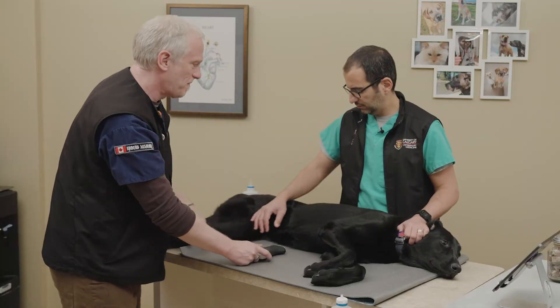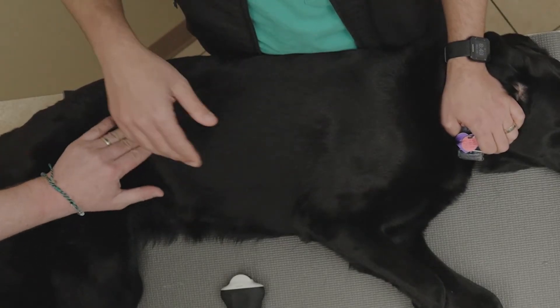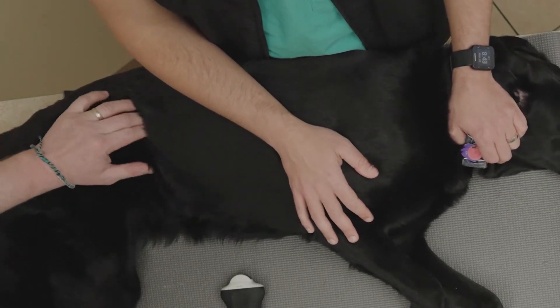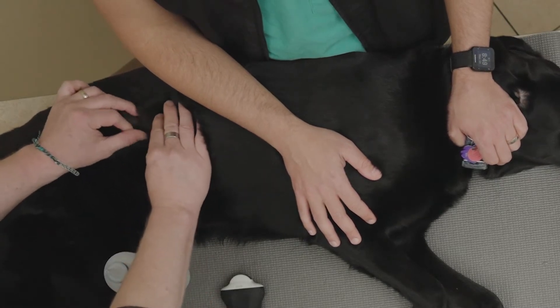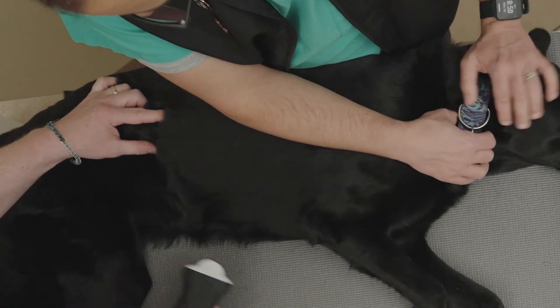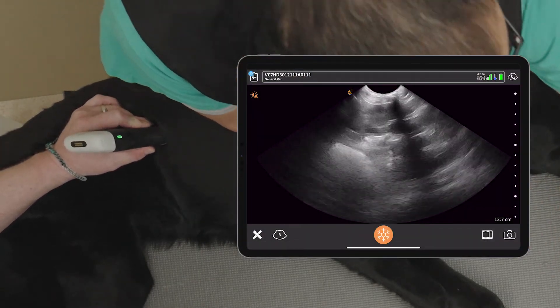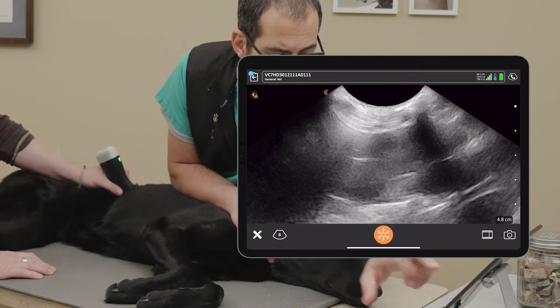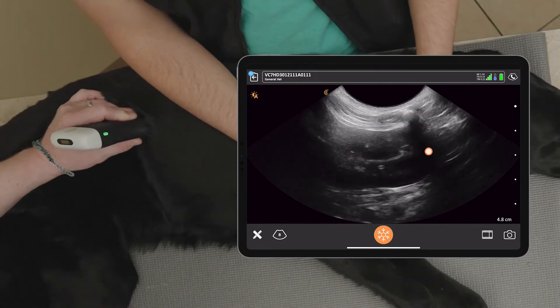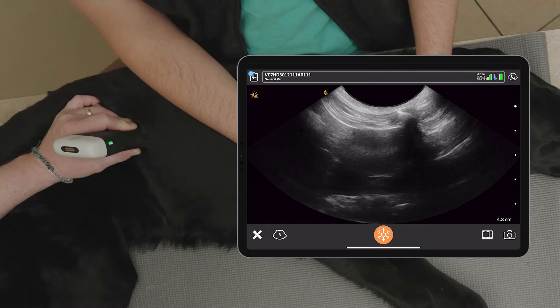Once we've got the urinary bladder site, we go after the sub-lumbar site. Penny is in left lateral here, so we trace the ribs up until we lose our finger in the sub-lumbar muscles at the last rib, then trace dorsally to find that sub-lumbar site. We separate the fur, apply alcohol, and place the probe with the marker towards the head at the right paralumbar site. We won't always see the kidney due to location, but here we have a really nice view of the right kidney just behind the ribs.